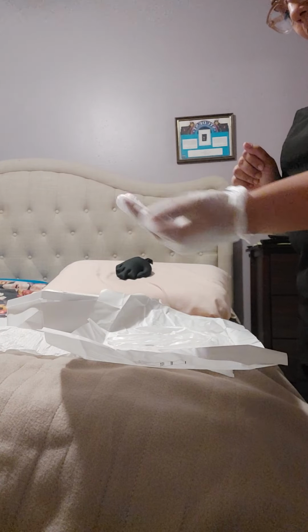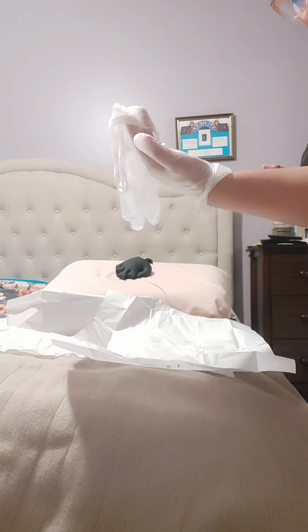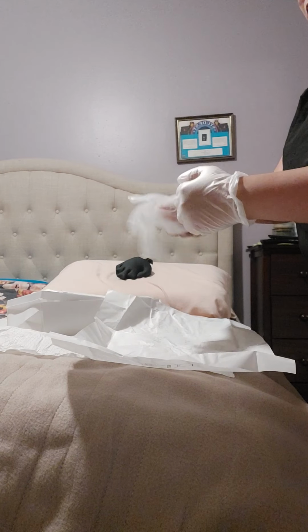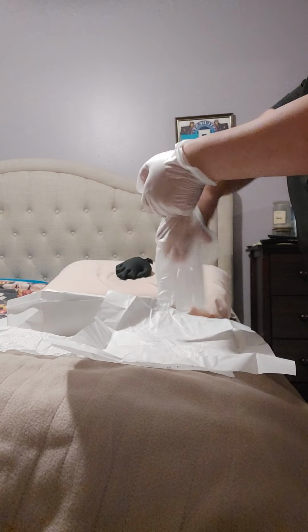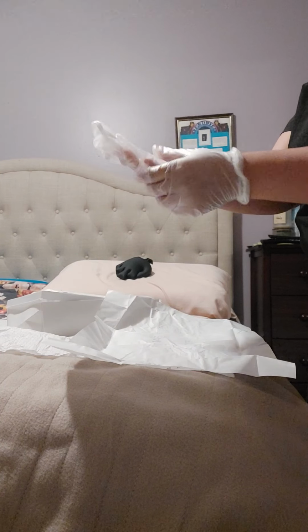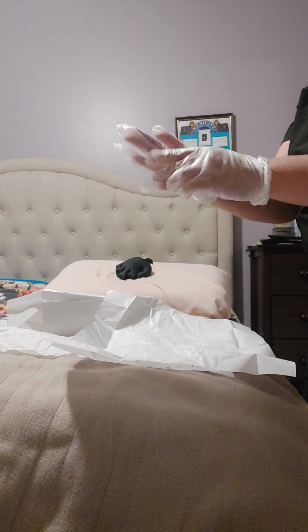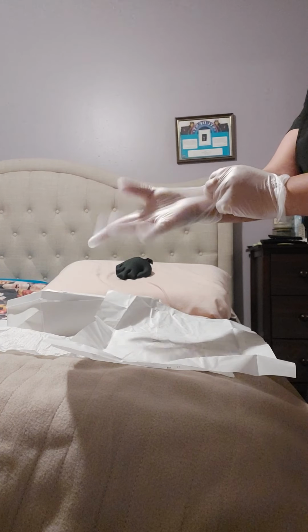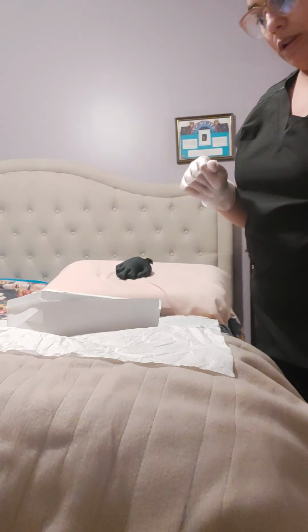Then to grab the next glove, you would use the cuff and put your hand underneath, like so, and put it on, making sure that you do not break sterility. Once the glove is on, you can touch the outside because this hand is sterile. Then I would dispose of this, touching only the middle because that is sterile, and throw it in my trash.